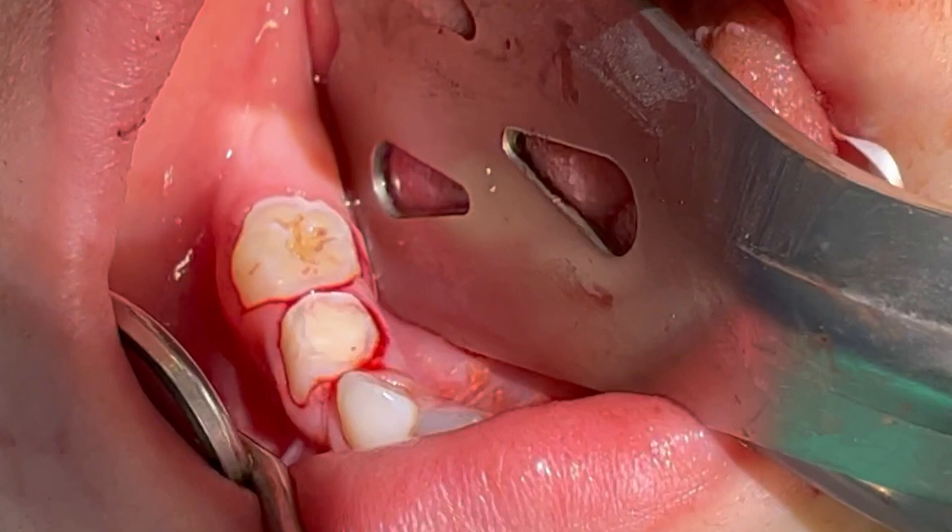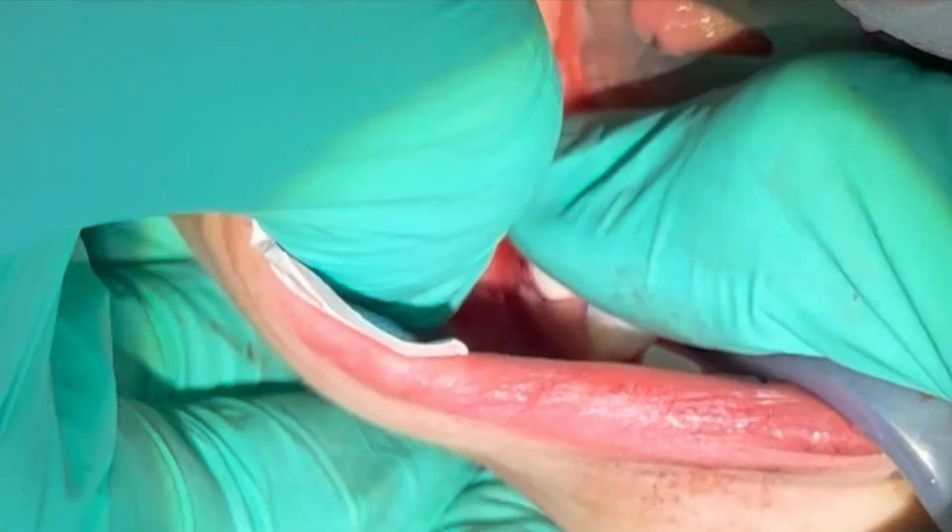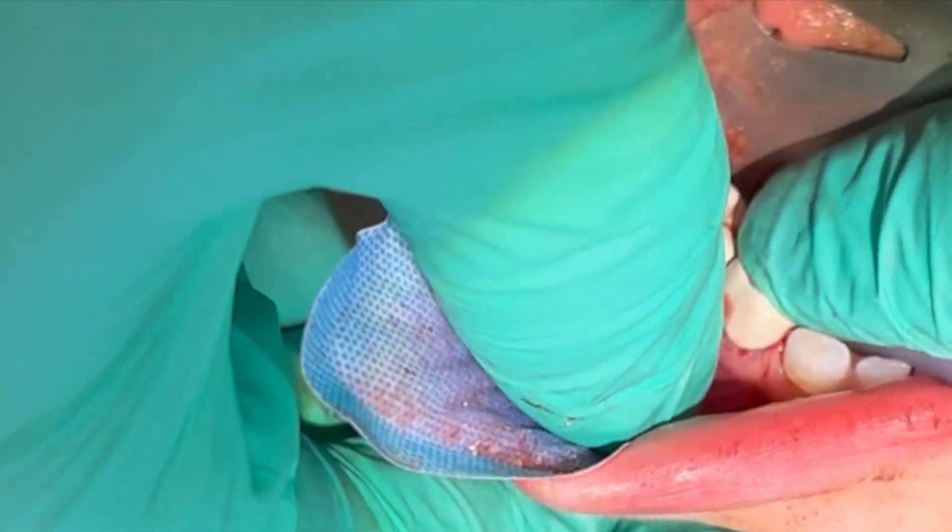While learning this prep, I have been prepping a stainless steel crown preparation and seeing what I have to do to alter that preparation to allow for the snug and active fit of my BioFlex crowns. Trying on the same crown sizes again, you can appreciate that the bounce has been removed and the crowns now have an active snug fit.